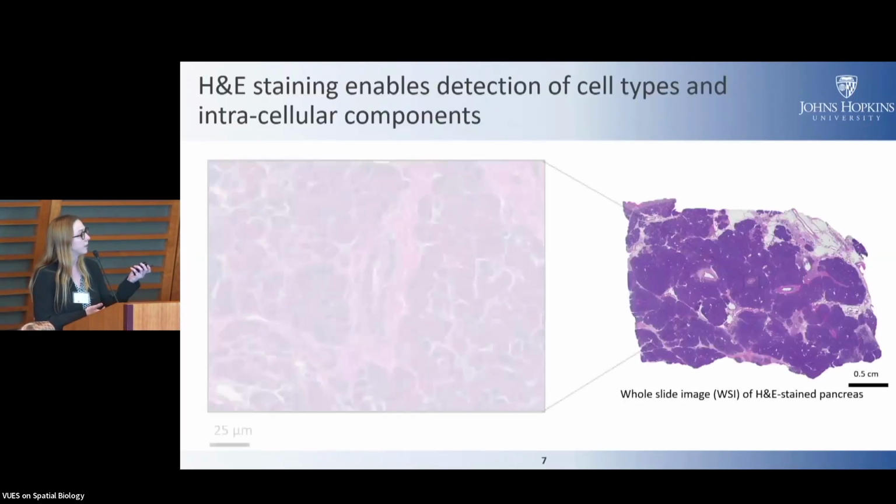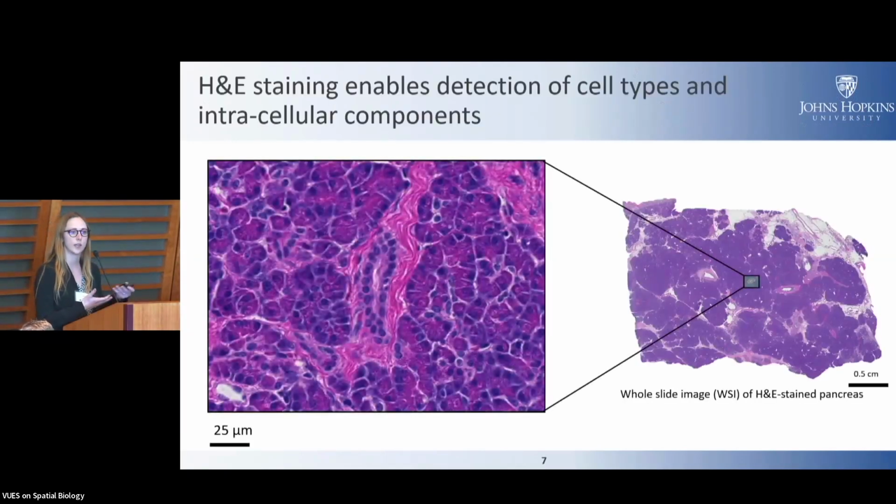So because Panin is so easy to see in H&E, we began with H&E. And actually, most of the data that we analyze with CODA is H&E. We'll cut thousands of slides instead of tens of slides, build highly quantitative, almost old-fashioned anatomical maps of tissue, and then use a lot of advanced multi-omic techniques to ask pinpointed questions at specific locations in those maps.